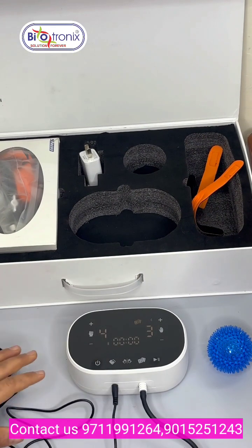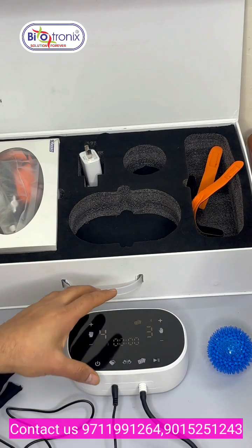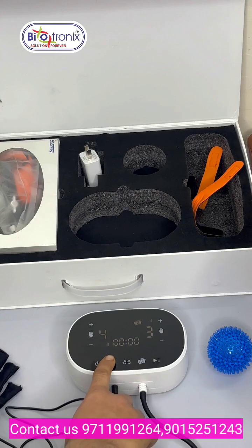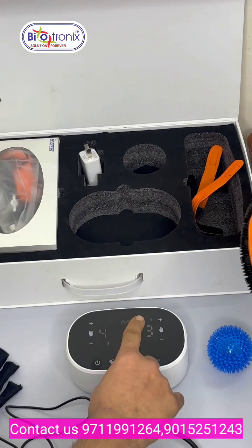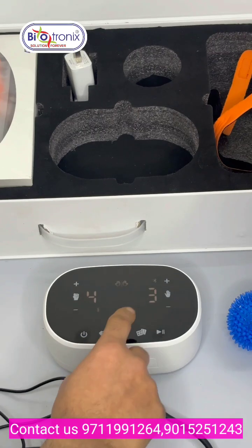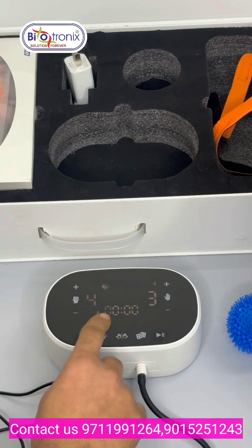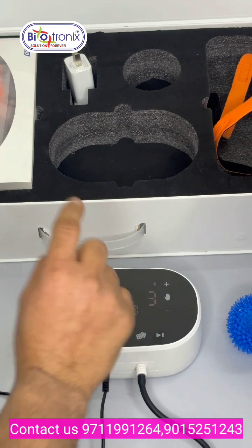Now you can see that this is the touch panel device, and there are three training modes. This is the passive training mode, this is the mirror training mode, and this is the active training mode. You just have to touch one, and you can select any of them. This is the passive training mode. If I select it, the indication will show the passive training mode.